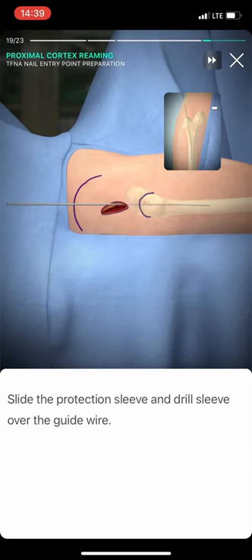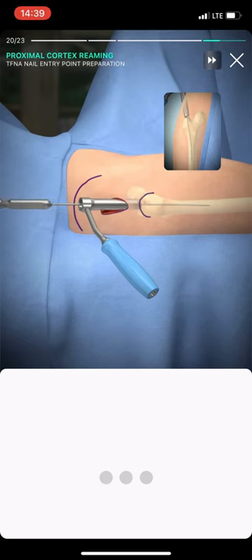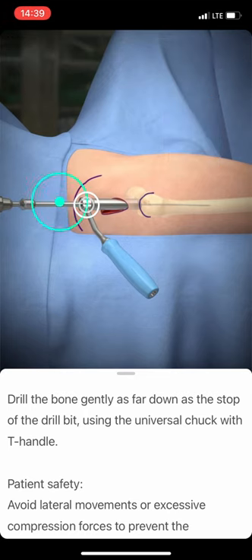Guide the 16 mm cannulated drill bit through the protection sleeve over the guide wire, until it is seated on the top of the greater trochanter. Drill the bone gently as far down as the stop of the drill bit, using the universal chuck with T-handle.